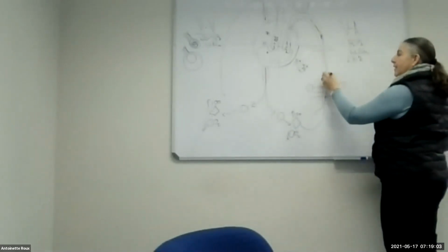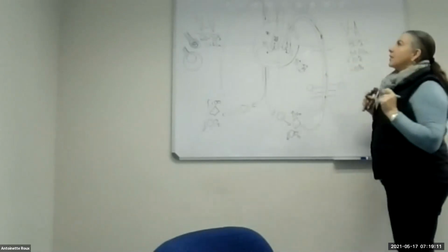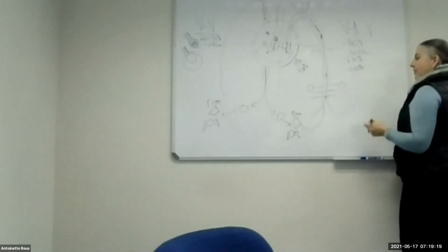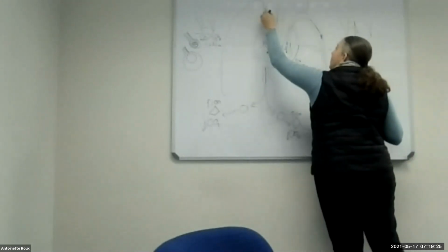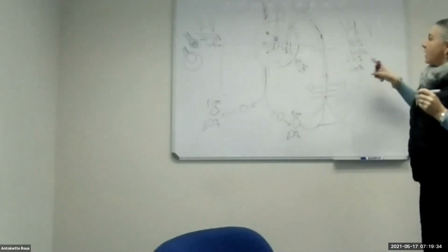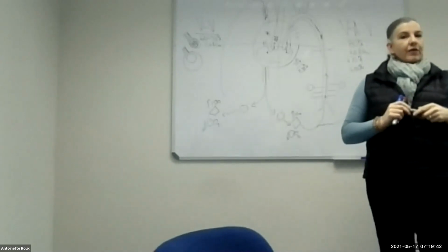So now you get down to about here, your native hearts are much better, and you almost went down to 20% here. But then you check your blood gases and you see that, oh, I still need some oxygenation to happen. So then what you do is, you make the Y connection here. You'll connect another cannula and go back into the internal jugular, so that you have oxygen-rich blood going in there and up into the pulmonary arteries. So that is what you'll do if you still need oxygen and you can't come off ECMO. Okay. So this is in short what VA and VV ECMO is all about.